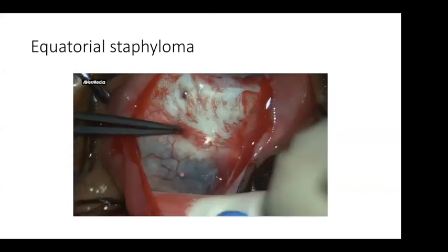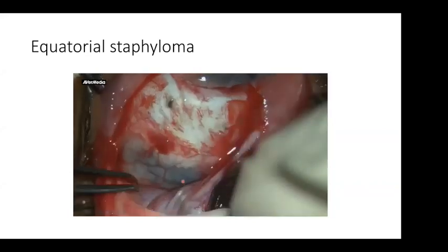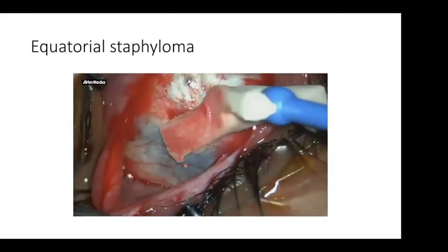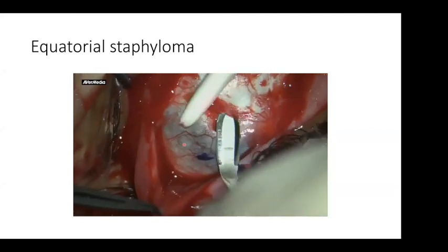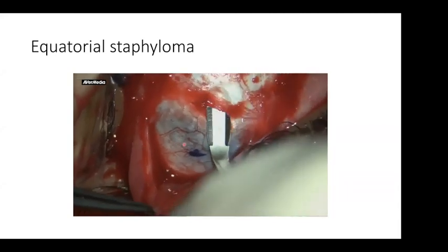This shows the ciliary body, that pigmentation in the episclera. But again, it is a very frightening appearance to see. And you need to think, I need to take my time. That's why I wipe a lot, just thinking what to do in this situation. Definitely, you can move to the inferior quadrant, but I don't want to do that, because I can face the same situation.